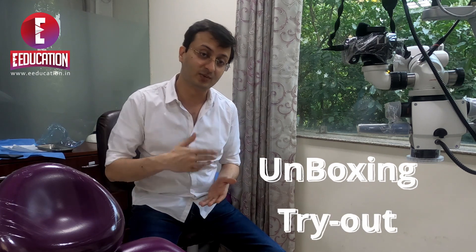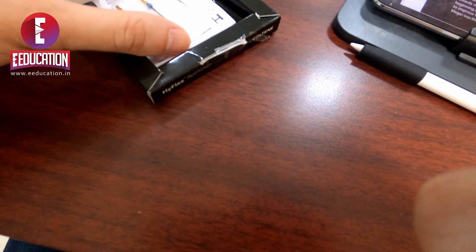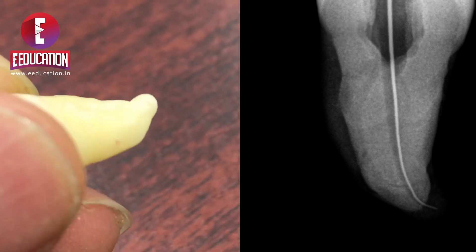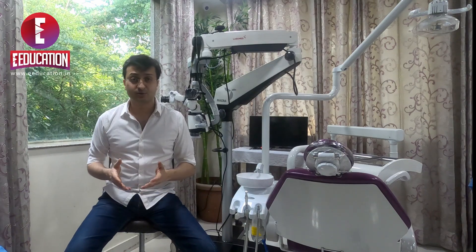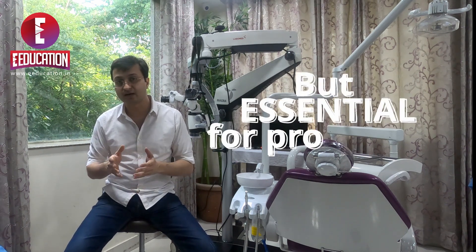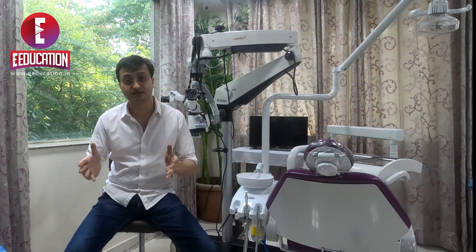The HyFlex Remover is a new addition to the Indian market. There isn't too much literature to read and go through, so this is going to be more of an unboxing and a hands-on try with a difficult tooth that we obturated. As somebody interested in both the academic and clinical aspects, let's understand what features differentiate this file from the spectrum of other file systems available.